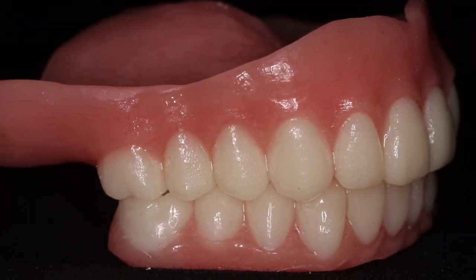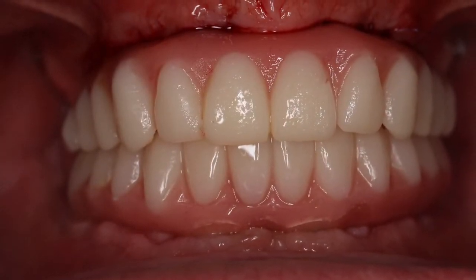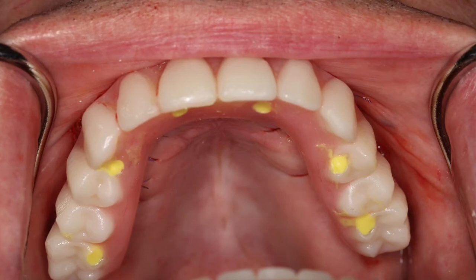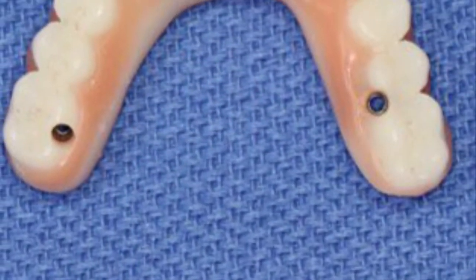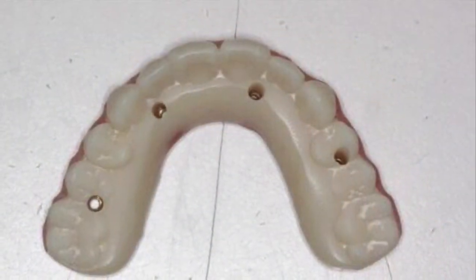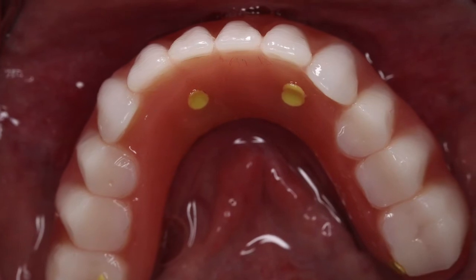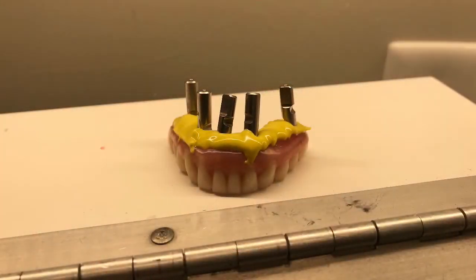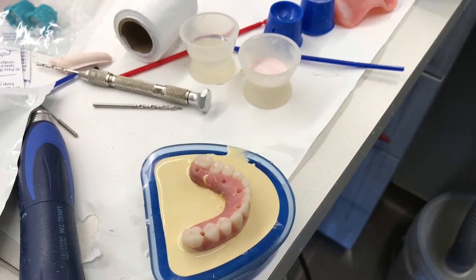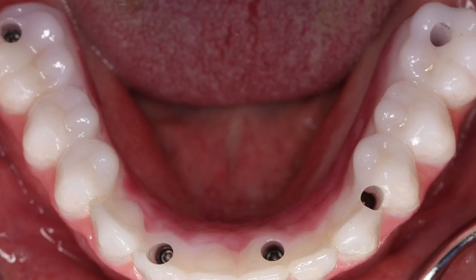Here you can see in the mandibular arch I start with the flanges already cut off. With the Smart Denture Conversions approach you end up with perfect occlusion and very minimally invasive screw access holes. Because the screw access holes are so minimal, it actually resembles what you'd expect to see in your final restoration. You can have a milled denture, a printed denture, or a conventionally processed denture — it doesn't matter — so long as it resembles the final restoration. You can then add your lab analogues and a Kish moulage, put it into stone, and give the laboratory exactly what you expect them to duplicate in zirconia.